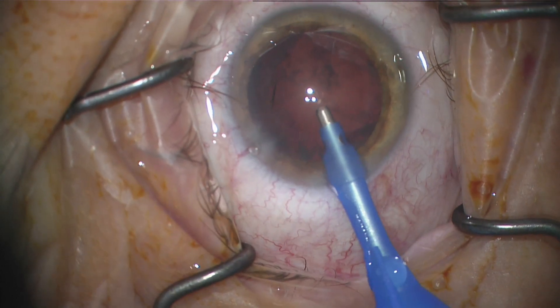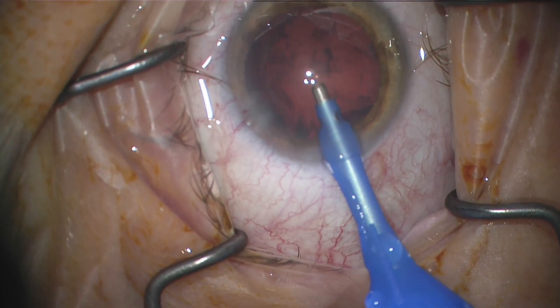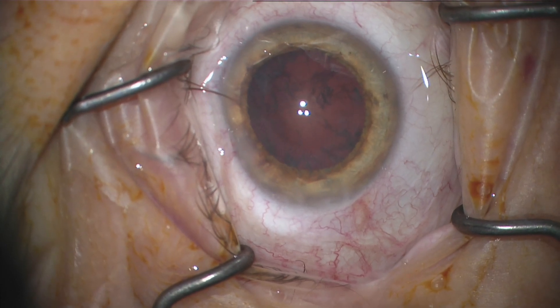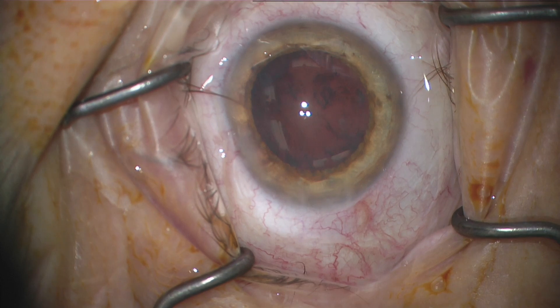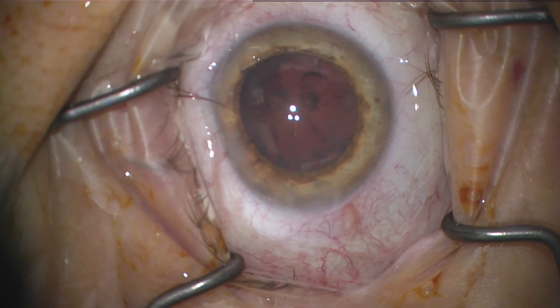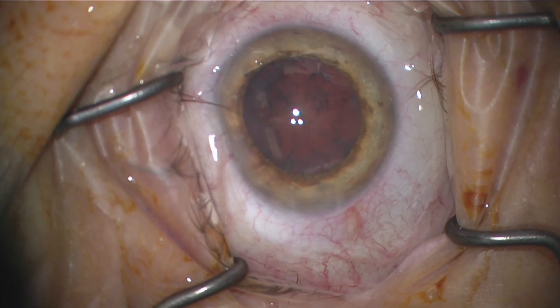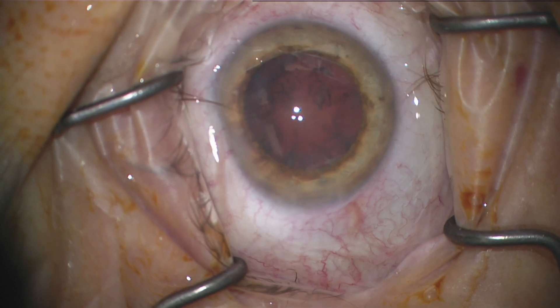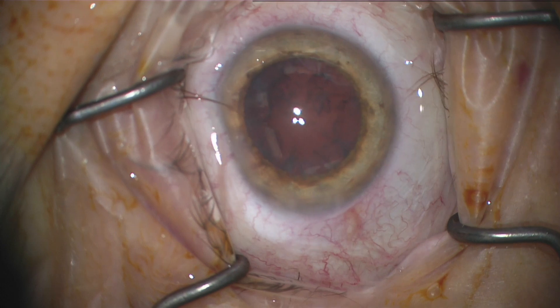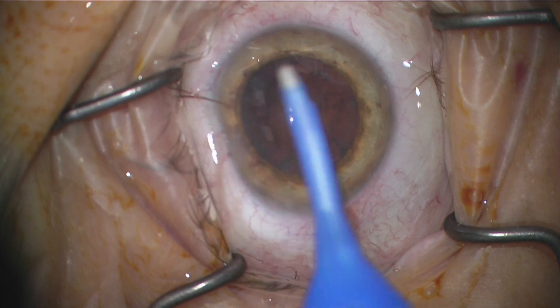As you can see it worked and we were able to get all of those pieces out. The advantage of having all the mechanics in one handpiece is you have less stuff in the room — you don't have to roll in a giant cart. It's good for office-based surgery, office-based cataract surgery, or mission trips — just less stuff to deal with, and possibly less expense too, although I don't know the numbers myself.